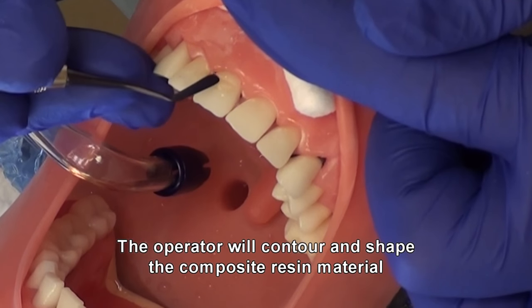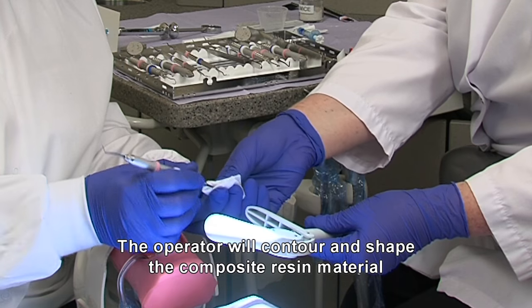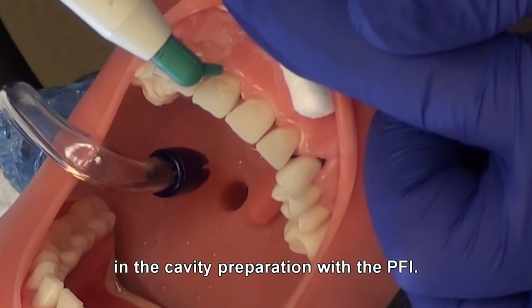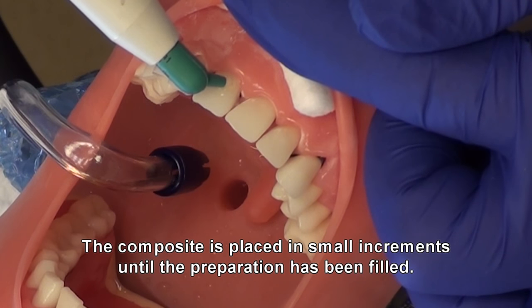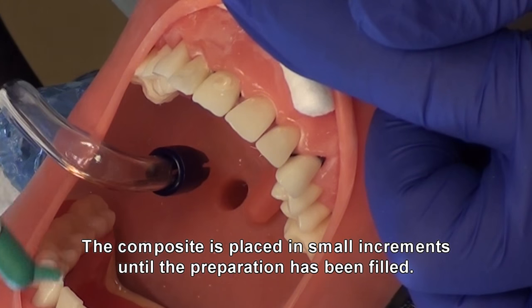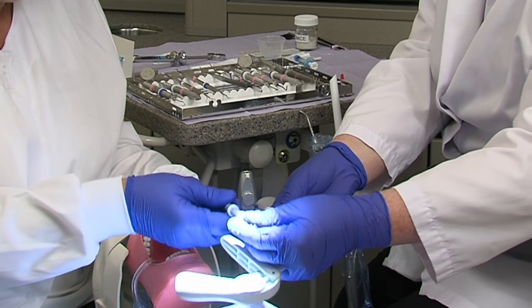The operator will contour and shape the composite resin material in the cavity preparation with the PFI. The composite is placed in small increments until the preparation has been filled.